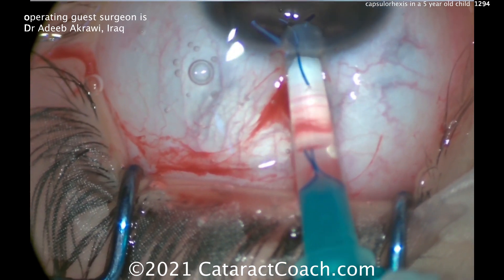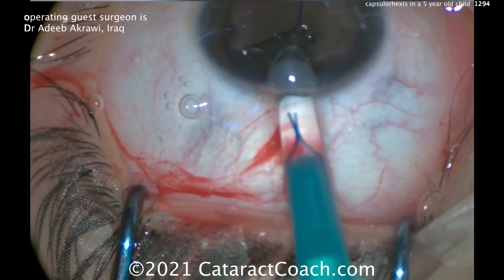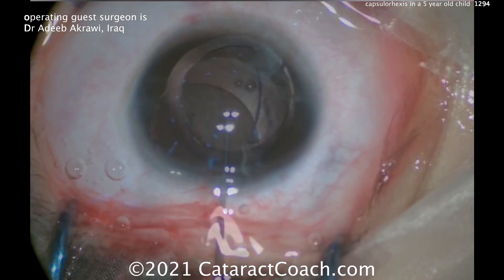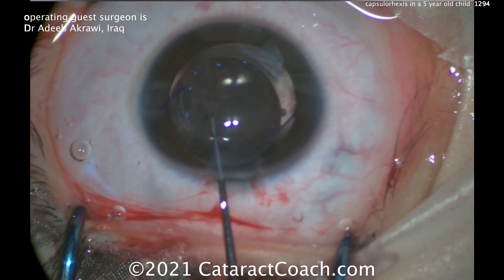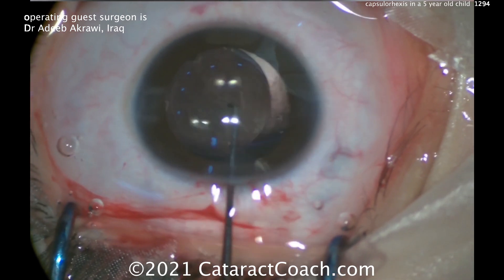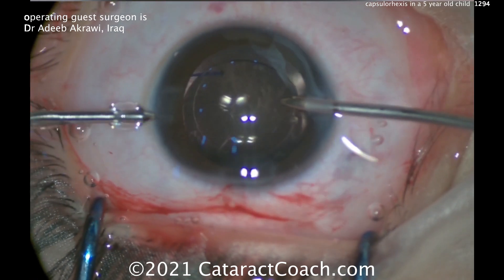It looks like a 3-piece lens going in. Remember our 7L rule: that first haptic should look like the number 7, and the trailing haptic should look like the capital letter L. Getting that in the capsular bag is really important — you want those lenses nicely and securely placed in the capsular bag, including that trailing haptic. That looks pretty good.